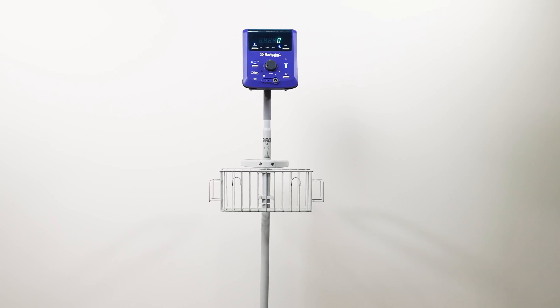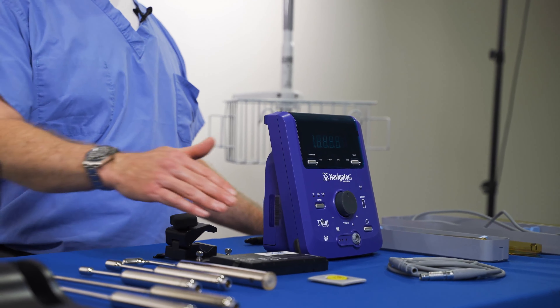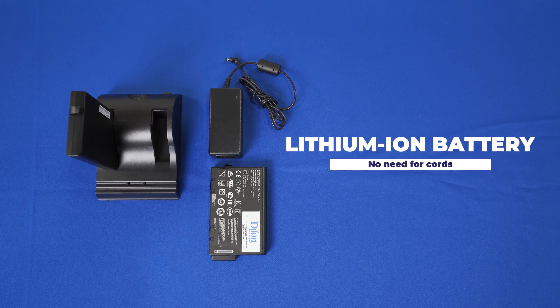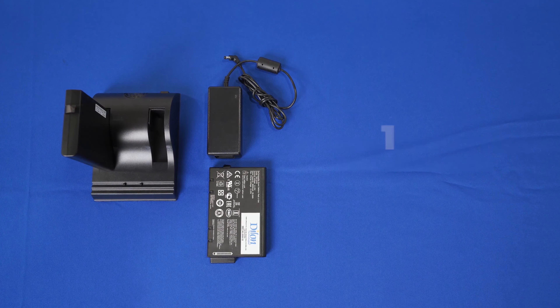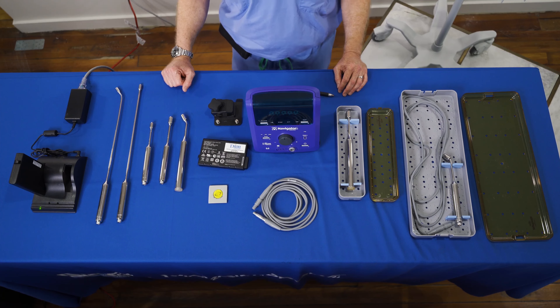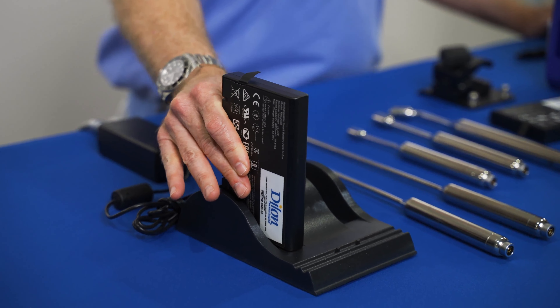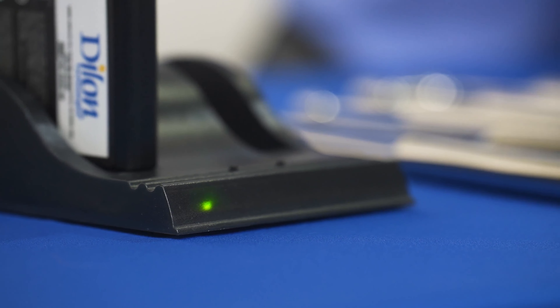The Navigator 2.0 control unit is rechargeable, cordless, and compact. It can attach to an IV pole or the Navigator rolling cart. First, you will need a fully charged lithium-ion control battery. Remember to always start a procedure with a fully charged battery. The battery mitigates the need for a power cord, which can add an unnecessary trip hazard in the operating room. A fully charged battery will provide over 10 hours of continuous use. To charge the battery, insert it into the charging cradle, which has two ports. The system comes with two batteries so you can charge them simultaneously.